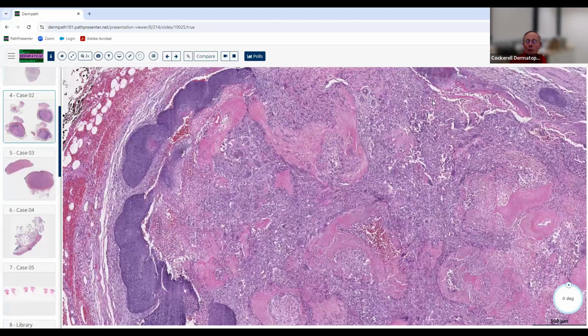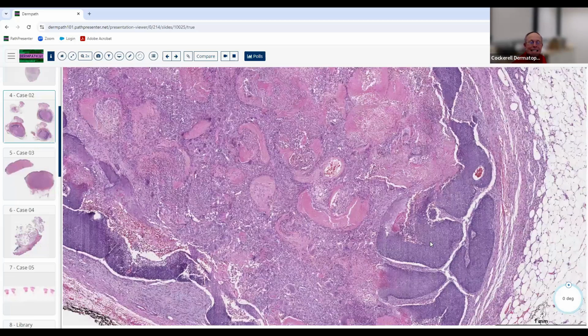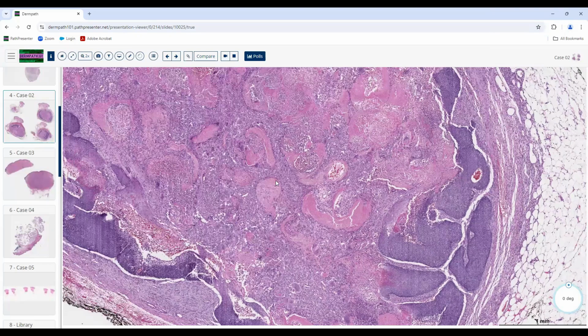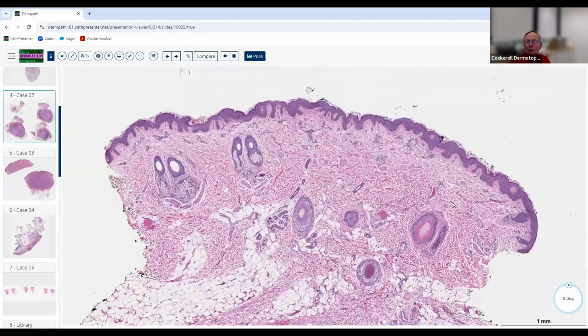Now, there are three parts of the hair follicle, right? Really four, but three major ones. So what are the three parts of the hair follicle, and which part of the follicle do you think this one is recapitulating? So I know there's the matrix. Good. Yes, there's the matrix, or the inferior portion of the follicle.